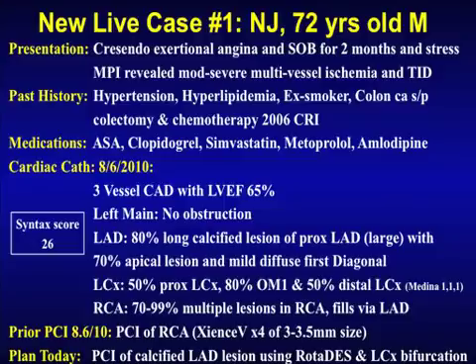He had a cath which revealed 3 vessel disease with a significant lesion of the right coronary artery, because of multivessel ischemia. Still the most significant lesion was in the inferior wall, and he has a normal LV function. He also has disease in the LAD and circumflex, which we will show now, with a SYNTAX score of 26.